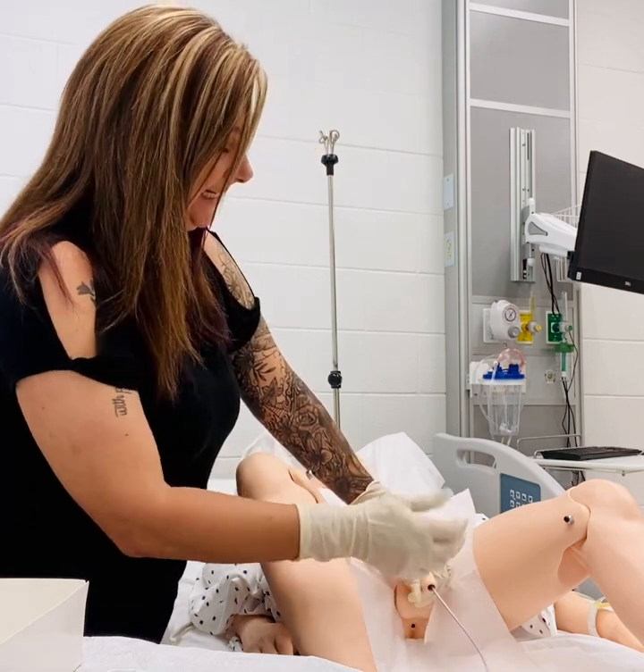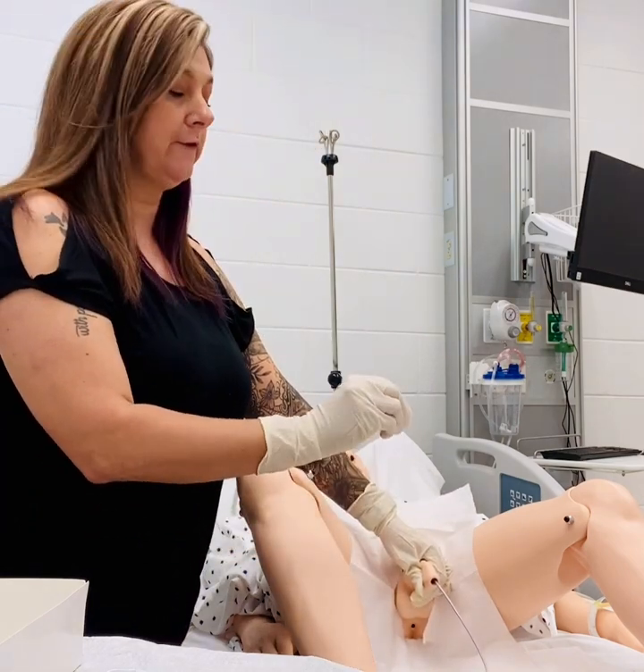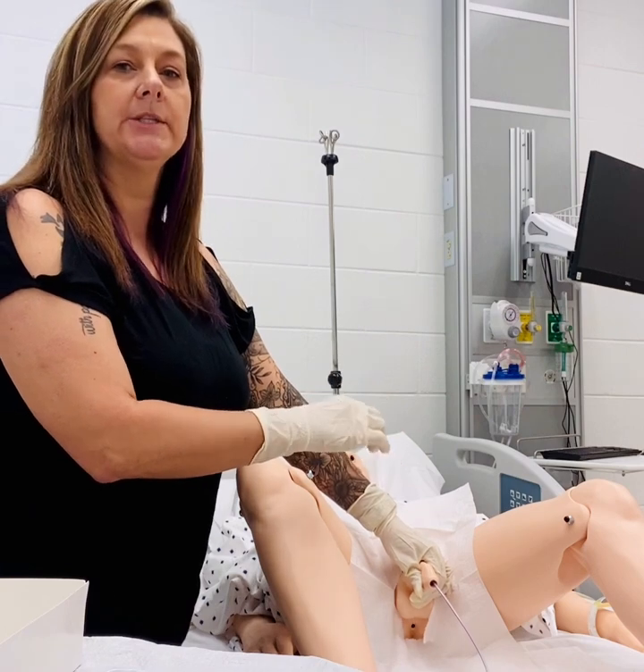After you have completed this, you'll want to ensure that you secure your Foley catheter to the side of the patient's leg using your securement device.